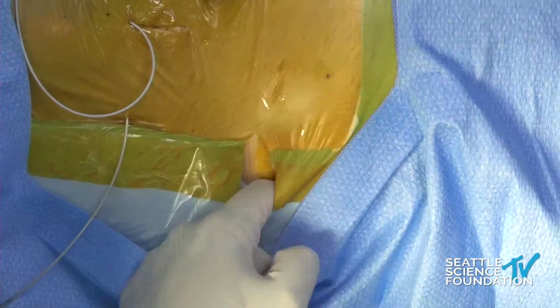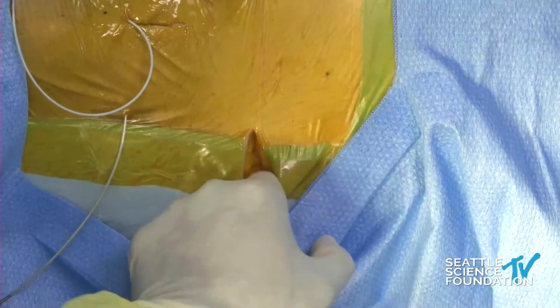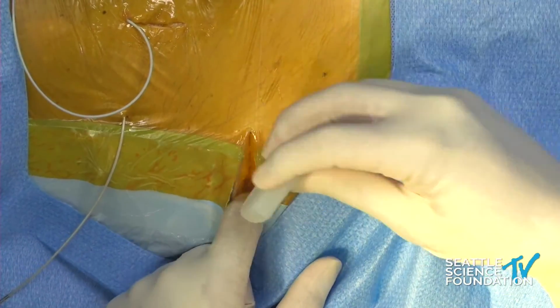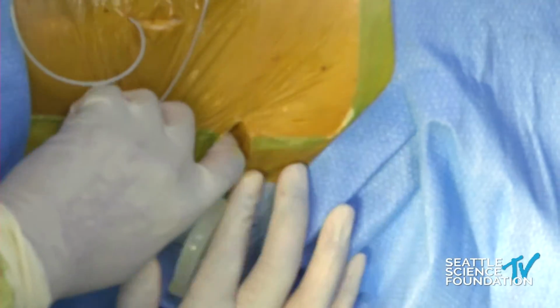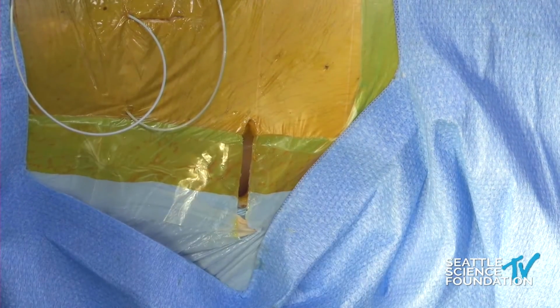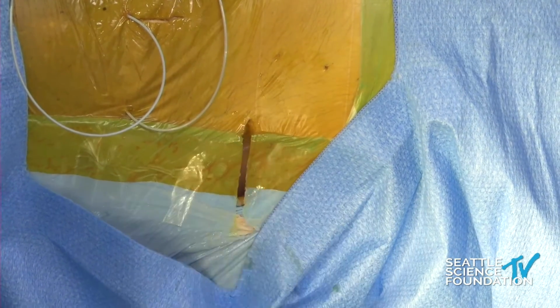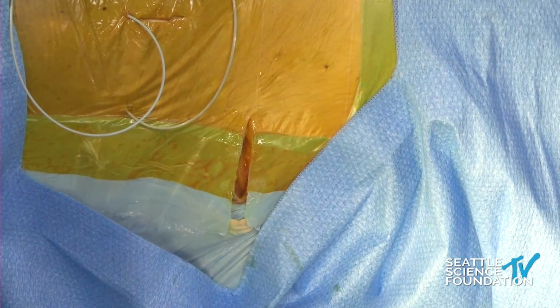So what you'll do is dissect that IPG site. I'll use finger dissection here. You can use Metzenbaums, electrocautery. This is a rechargeable system, so I'll make sure that it's about 2 centimeters in depth. You don't want to be too deep because otherwise recharging could be not really capable. So we're at about a 1 centimeter, 1.5 centimeter depth here. You can see I just slipped the template in. That's when I know, great, my IPG is going to fit just perfectly.